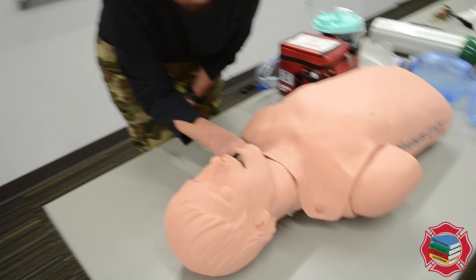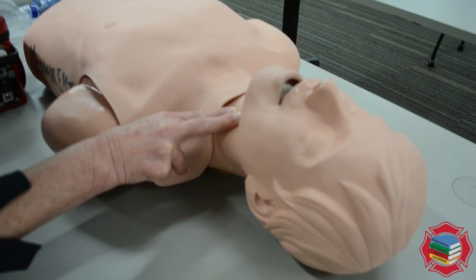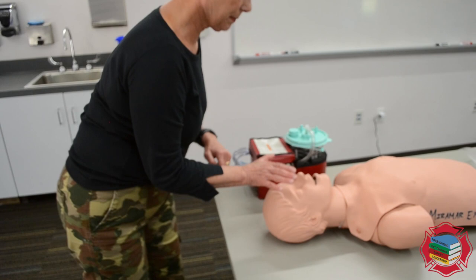Then I will check pulse and breathing. I'm checking the pulse at the carotid site, as this is a patient greater than a year of age — putting my two fingers lateral to the thyroid cartilage, inferior to the angle of the jaw. I'm checking pulse and breathing for five to ten seconds: 1-1000, 2-1000, 3-1000, 4-1000, 5-1000. The patient has a weak pulse but no breathing.